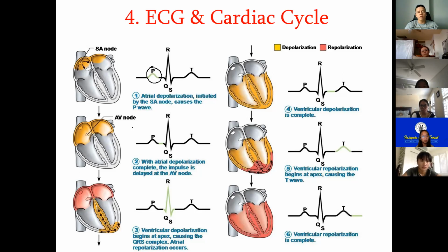Okay, it is picking up the depolarization and the repolarization, because an ECG is measuring electrical impulse going through the heart, not the contraction. But we do know that it happens. It is the automatic result of a depolarization, the same way that a relaxation is an automatic result of repolarization of the membrane. Okay.